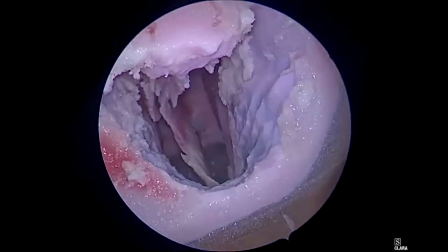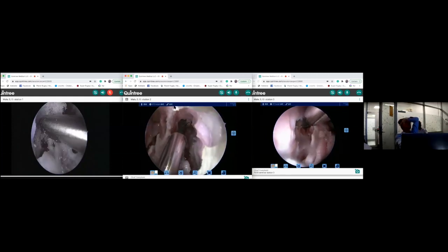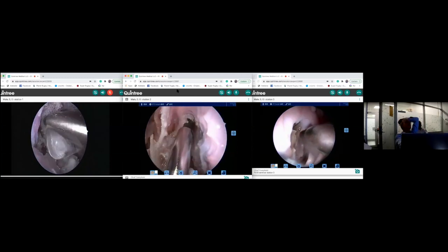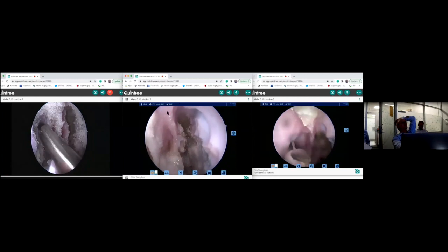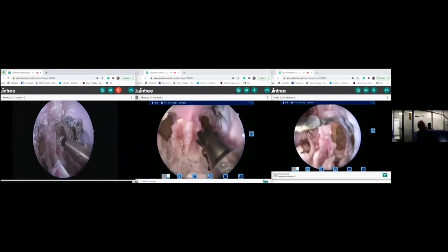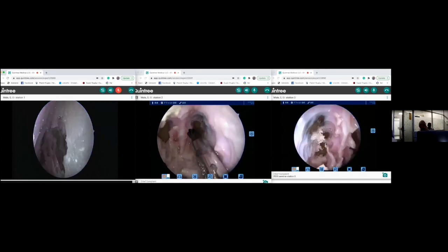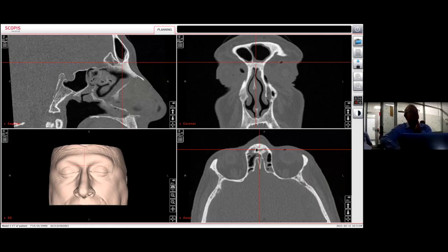Each of the dissectors is now monitored and tutored on all of the finer aspects of the frontal drill-out procedure. You can see you entered the olfactory neuron. You need to come across here. Station three is very good. You can see where the olfactory neuron is. Now you can join the two sides. If you look here on the axial scan, what you've done is you've drilled the bone away here and exposed this part.